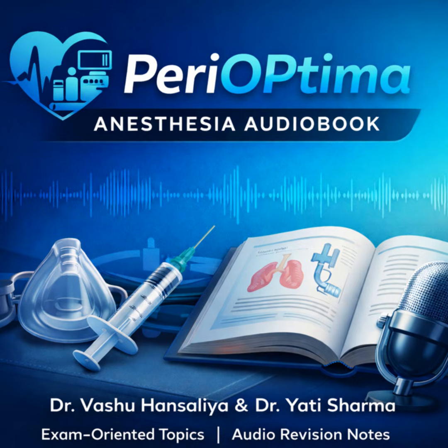Okay, let's get into the blades themselves. High-yield stuff. Let's start with the king, the Macintosh blade. The Macintosh is the standard for adults. It's a curved blade, and it's designed for an indirect lift of the epiglottis. You have to know the key features. You do. The spatula and flange create that unique reverse Z shape in cross-section. The tip is blunt to minimize trauma. And you need to know the sizes. Size 3 is your standard medium adult. Size 4 is for larger patients.